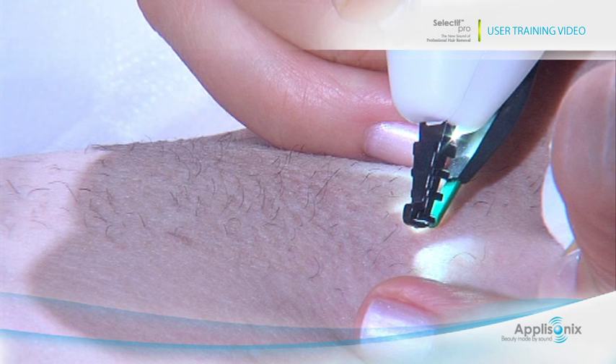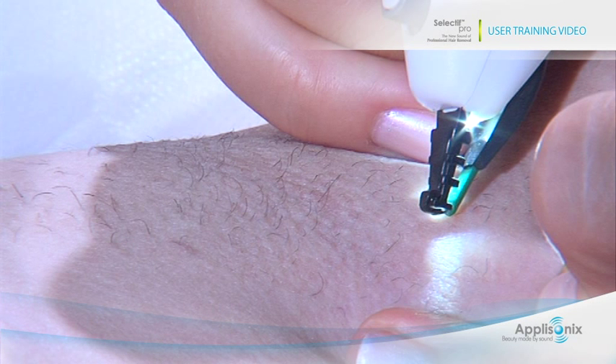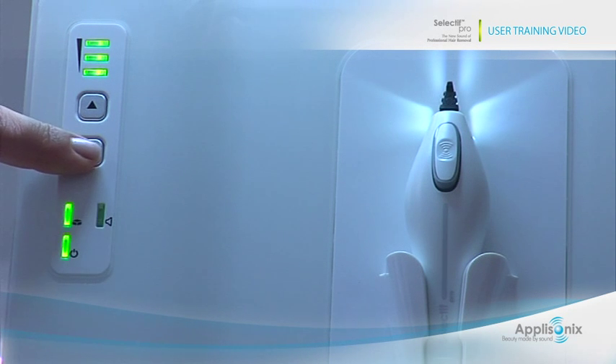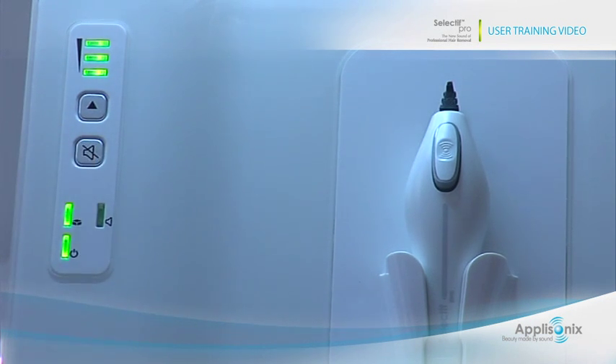Stay still until the light and sound are over. Step 3: once the ultrasonic pulse is over, you have the option to push the rear button and gently pull out the hair. Even if you don't pull the hair out, it should eventually fall out on its own. If you choose to turn off the sound, press the mute button. You can also turn off the illumination light by pressing the mute button for 3 seconds. Note that the light will still flash during the pulse.